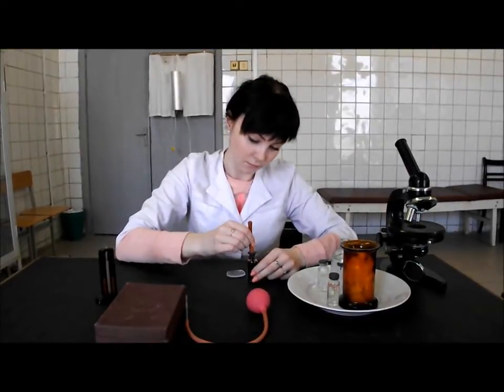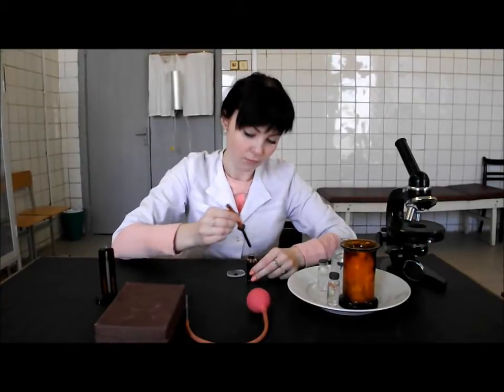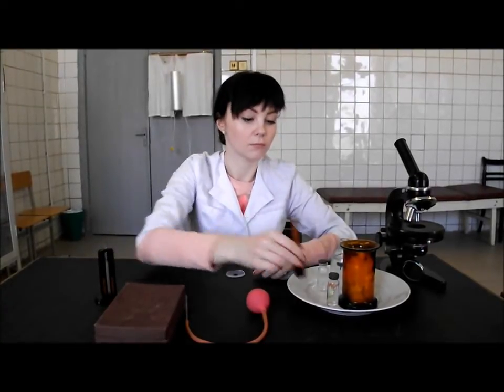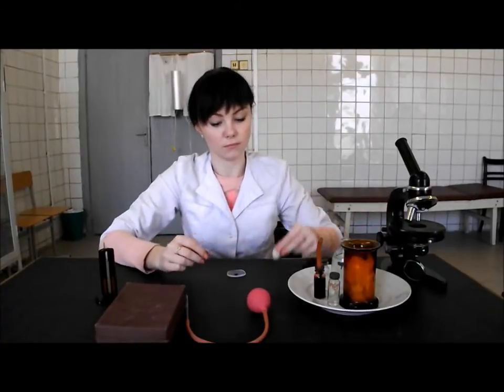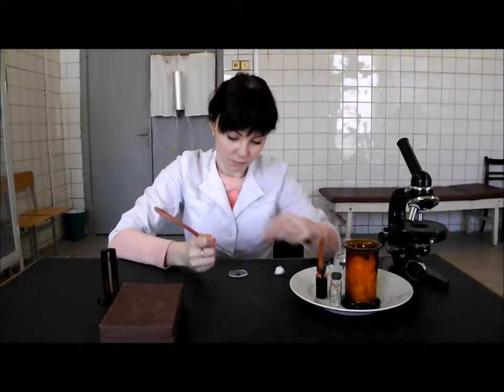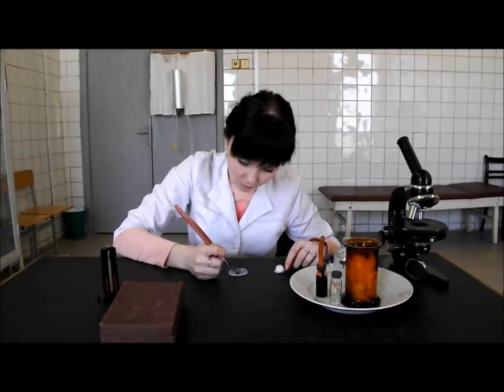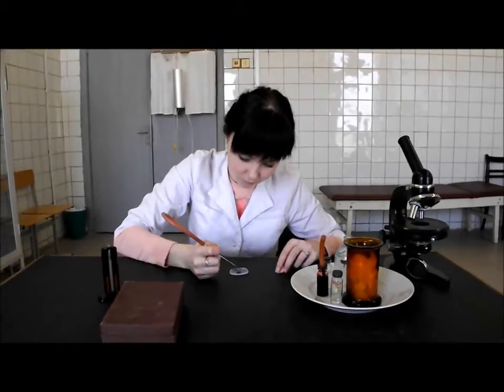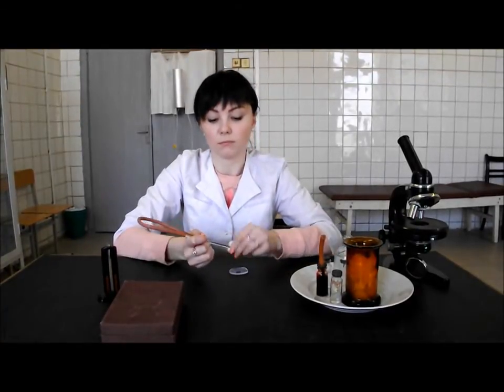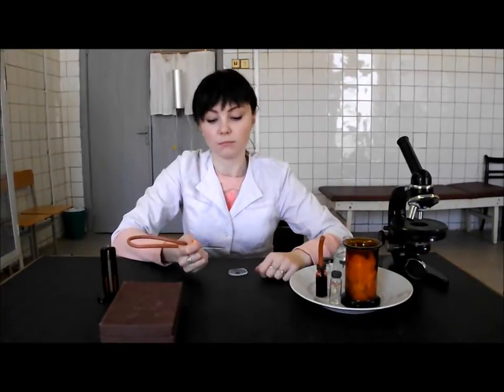Put the donor blood on the watch glass. Prepare a piece of cotton wool. Take 0.02 ml of donor blood into the capillary. Cleanse the tip of the capillary with the help of cotton wool, then put the used cotton wool on the plate.